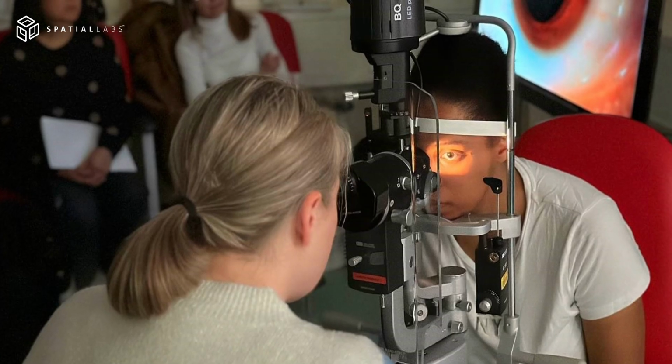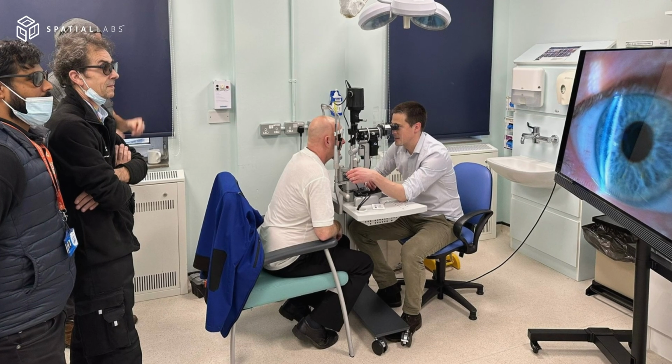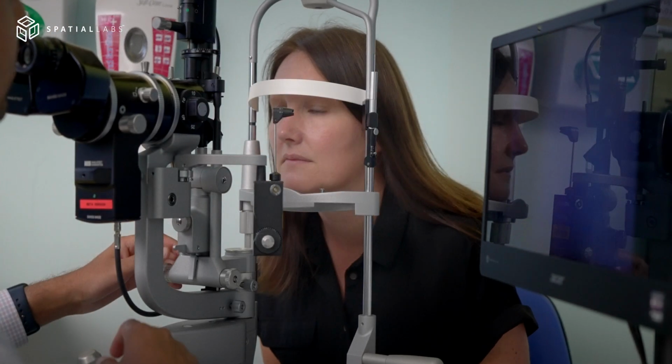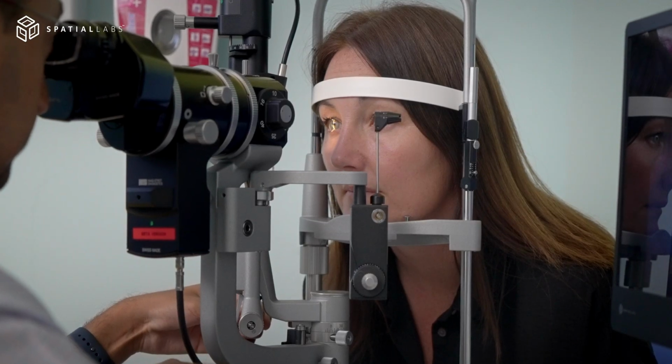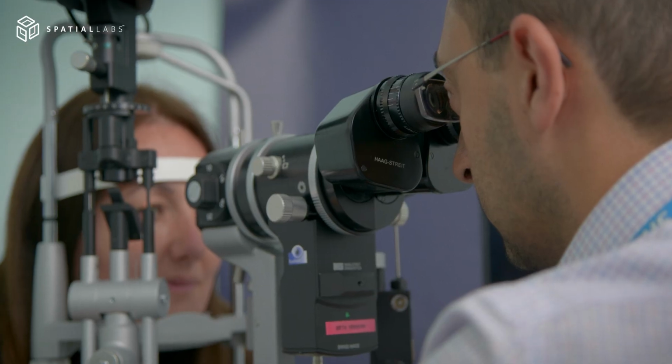Ideally, we need a solution whereby every slit lamp has a camera system attached to it. We can record the consultation for every single patient, and at subsequent visits, we can replay those consultations back in high resolution, but in 3D as well. Because the slit lamp, the microscope that we use to examine all the patient's eyes, is a 3D microscope. We use binoculars with one ocular giving an image to each eye, allowing us to view a stereoscopic 3D view of the patient's eye.